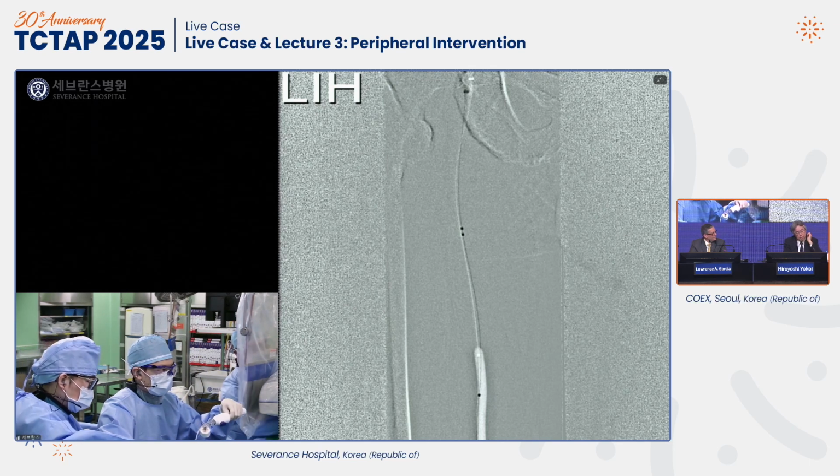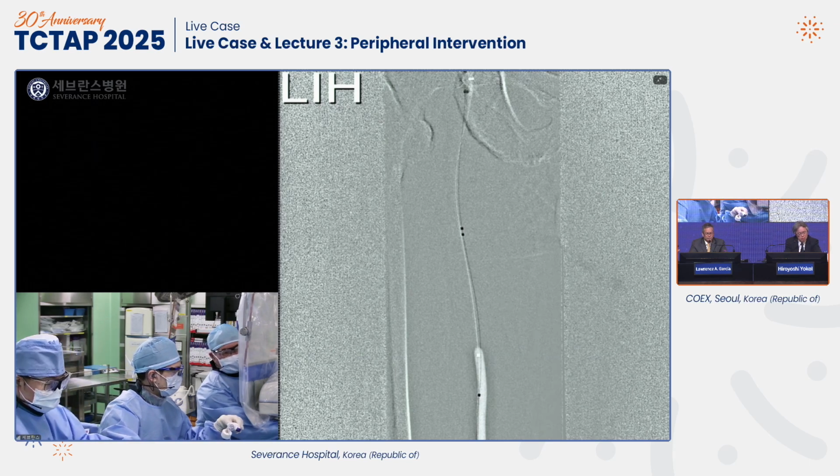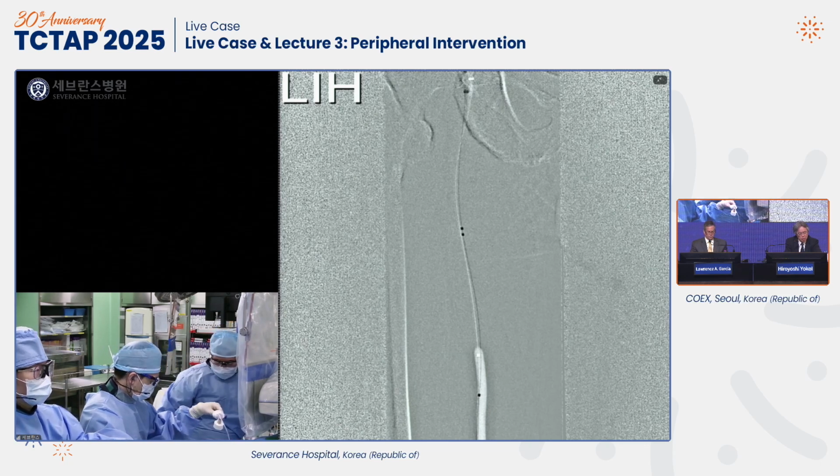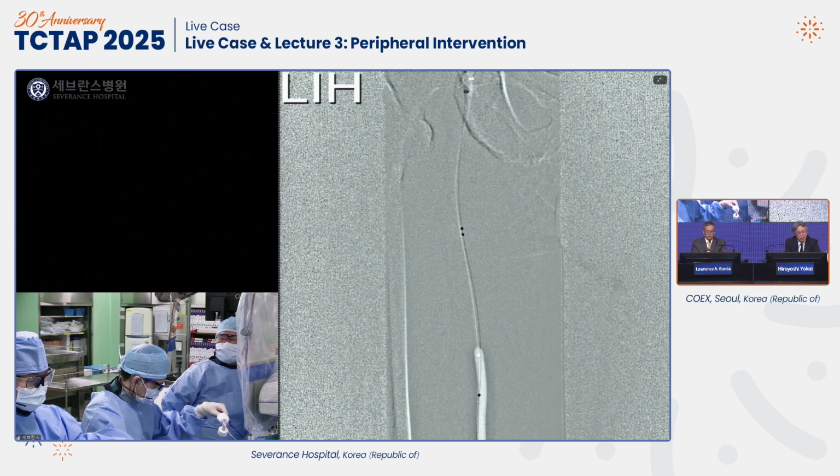Dr. Ko, I'm Yokoi. I have one question. I would like to ask your thoughts on the low-dose paclitaxel-coated balloon versus high dose: similar or different? How do you think about that?